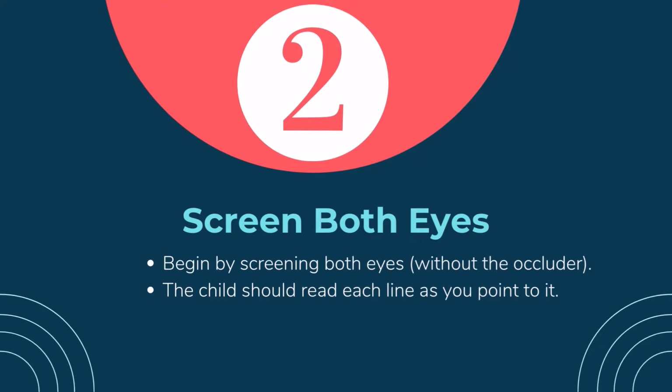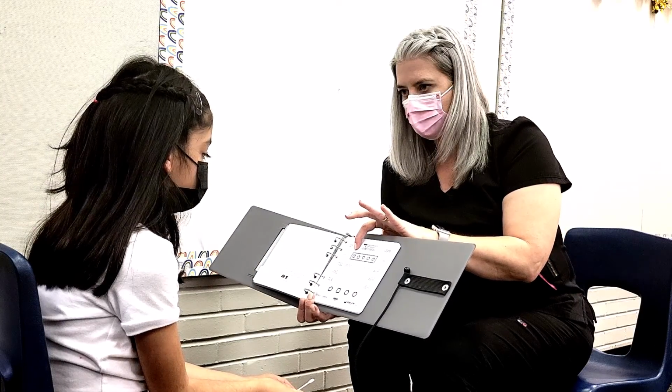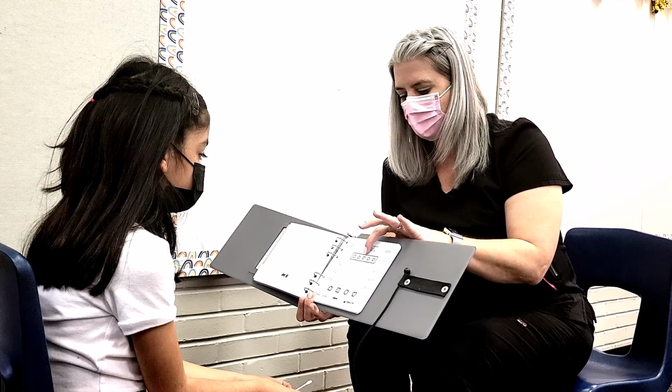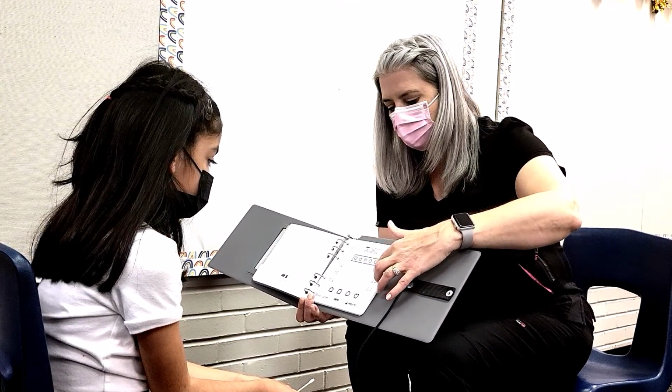Next, you will screen both eyes with no occluder. In addition to providing a measurement of the child's vision as a whole, this also provides the child with the low-stakes opportunity to acclimate to using the chart. It also allows the screener to make any necessary adjustments, such as switching to an LEA chart.